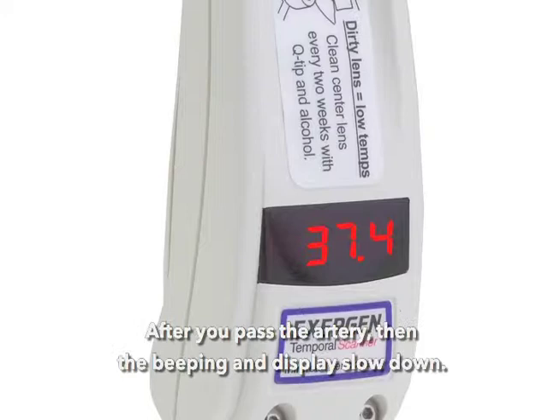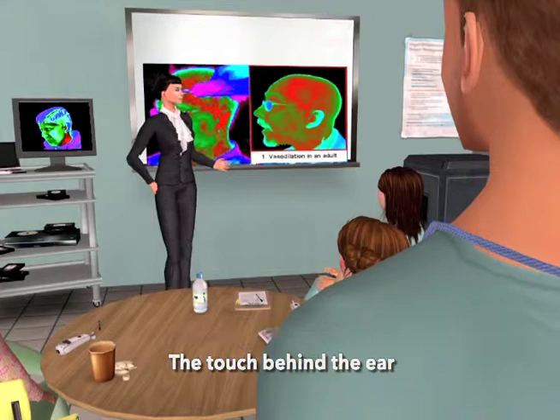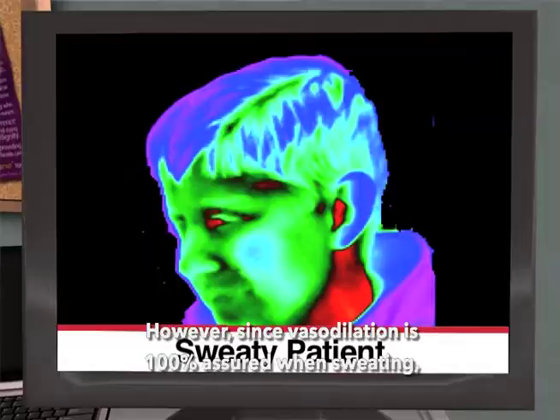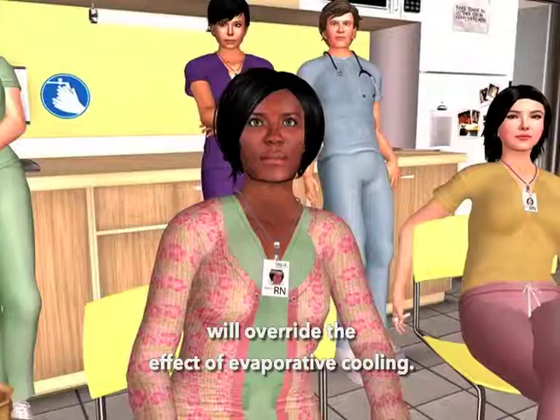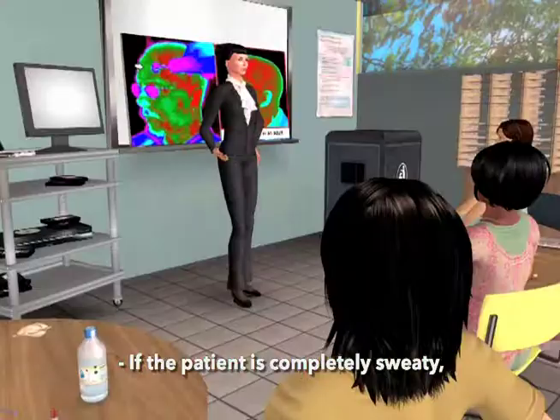Why the touch behind the ear? The touch behind the ear is to assure the correct reading if the patient is sweaty. If the forehead is moist, evaporative cooling will result in a low reading. However, since vasodilation is 100% assured when sweating and we sweat least on the neck, that touch on the neck just behind the earlobe will override the effect of evaporative cooling. If the patient is completely sweaty, return in about 10 minutes to take the temp when they're dry.